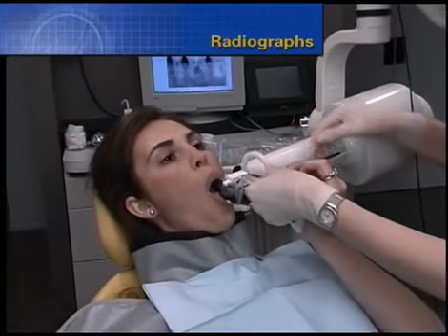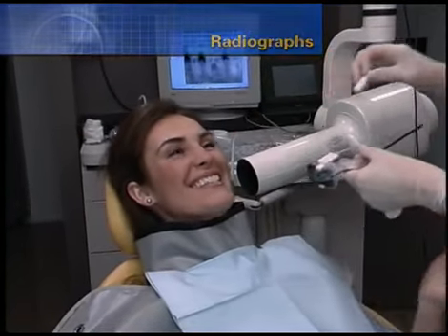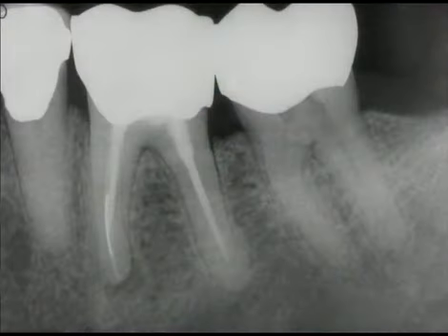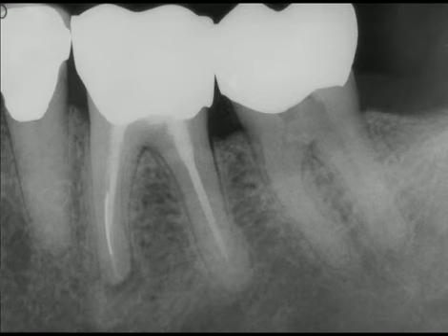Once again, clinicians should take 3 well-angulated radiographs prior to initiating treatment. Specifically, in broken instrument removal, this allows for better appreciation of the cross-sectional diameter, length, and curvature of the canal, root morphology, and the overall position of the obstruction.